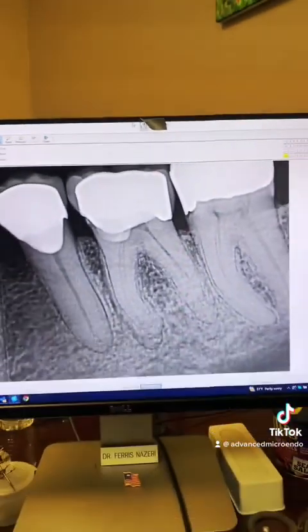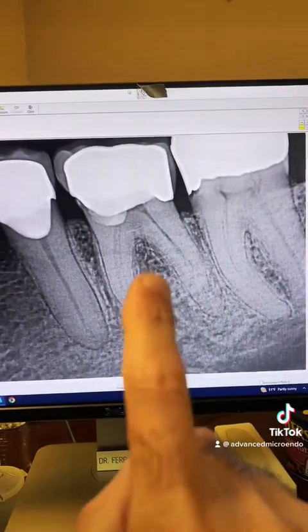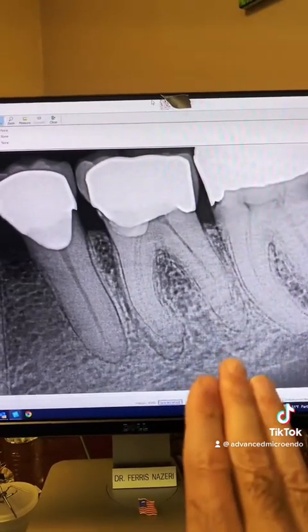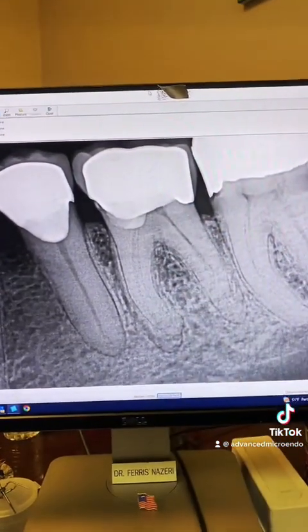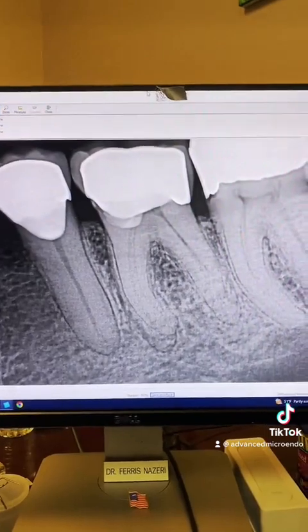This patient was referred to me for endodontic treatment of tooth number 19, porcelain crown, hot tooth. Patient was in a lot of pain, pain to percussion, throbbing pain. I couldn't even touch the tooth with my finger. He couldn't even touch the tooth with his tongue. That's why it's called a hot tooth.